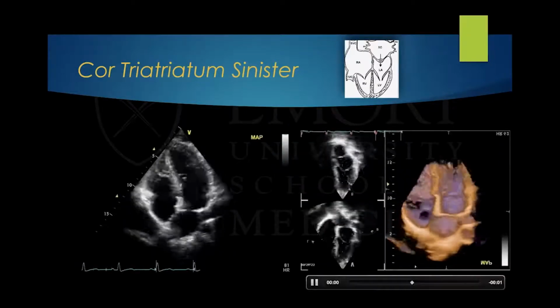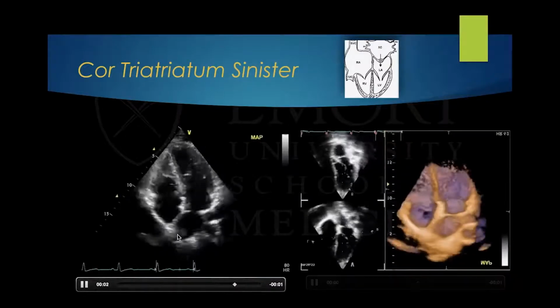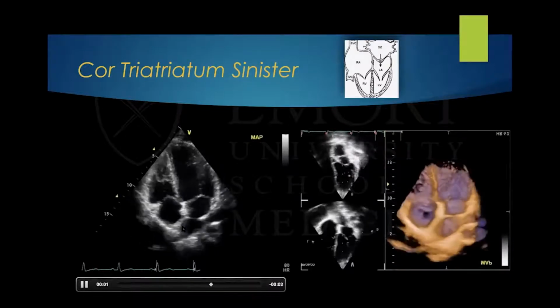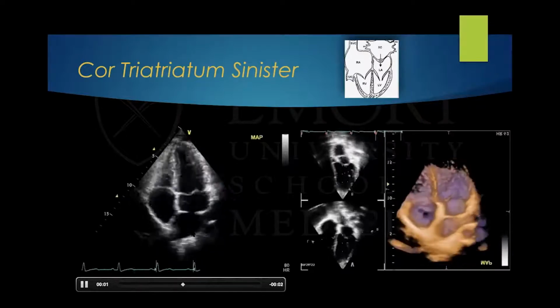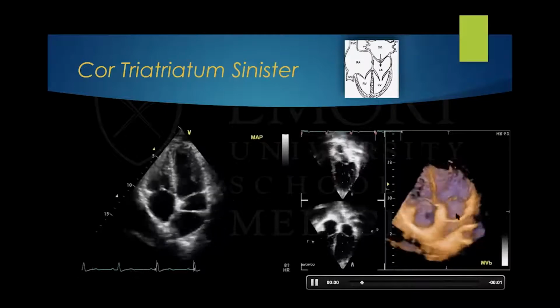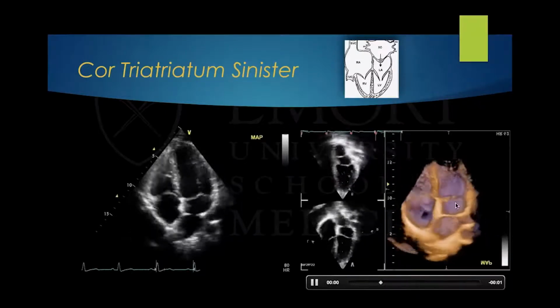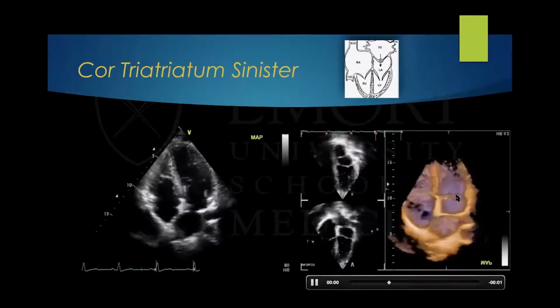And then here's some 3D demonstrating the same views that you see, pulmonary veins draining into the superior portion. And then here you will see it nicely. And the orifice is right here in the middle. This is the distal portion and the mitral valve.